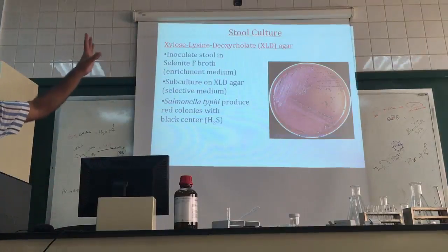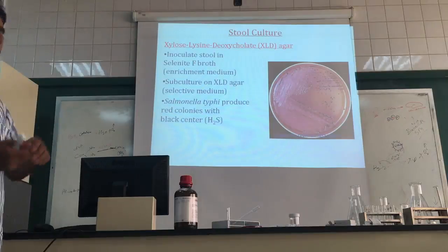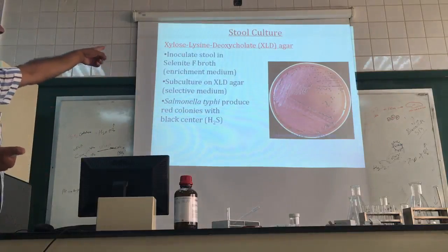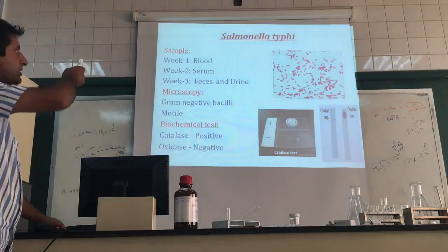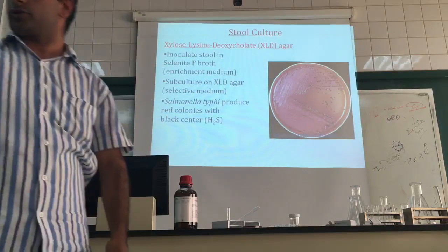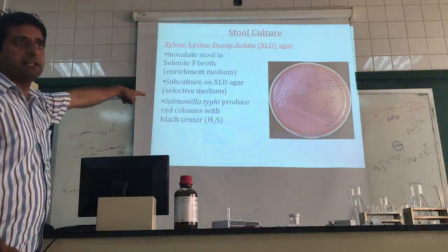This is one more culture media, if you want more tests, okay? Once again, more confirmation. XLD is xylose lysine deoxycholate agar. What you do, again, you culture this sample. As I told you, week-wise: blood, serum, stool and urine, okay? So here in the XLD, if the doctor advises stool collection from the patient, you do it first in the broth, in the liquid, there is opacity. Next day you will do culture on XLD, okay?